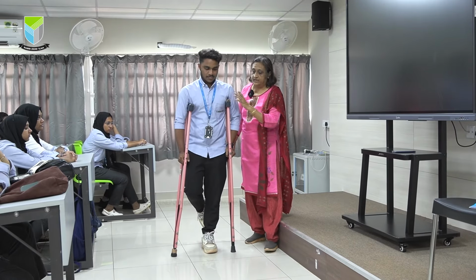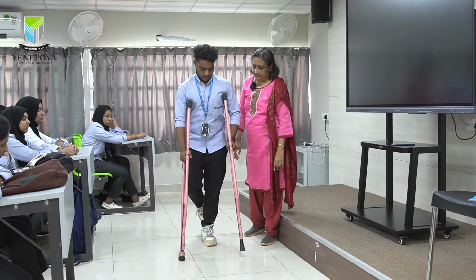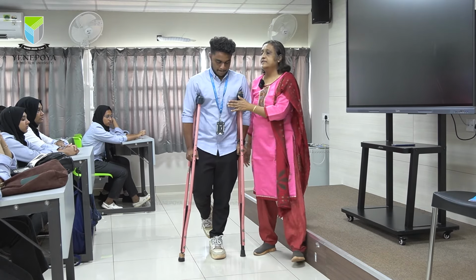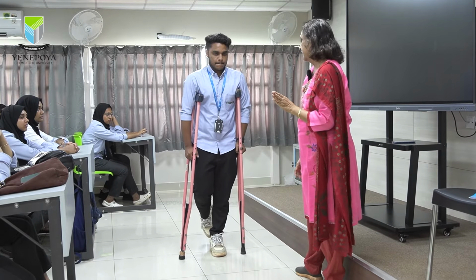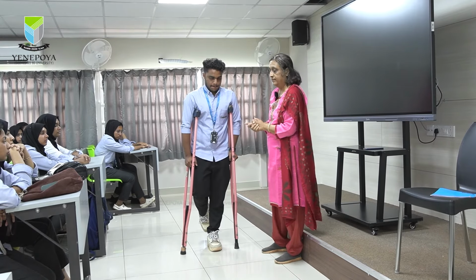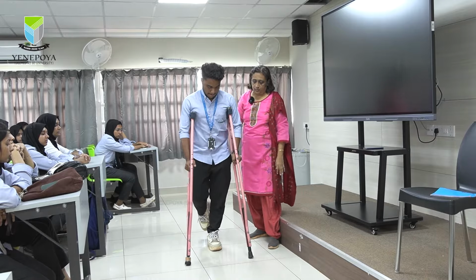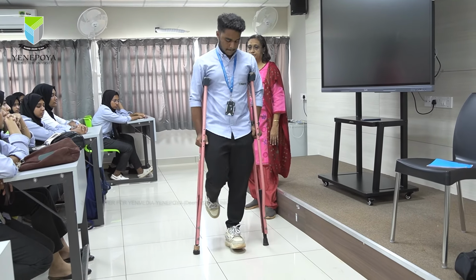What he is doing is right, 1 crutch forward, then the second crutch, and he is coming in line with the crutch, and this is called a 3-point gait, swing 2 pattern. Because the person is advised by the doctor not to bear weight on that limb, he is walking with the swing 2 gait, 1, 2 and 3, 1, 2 and 3.